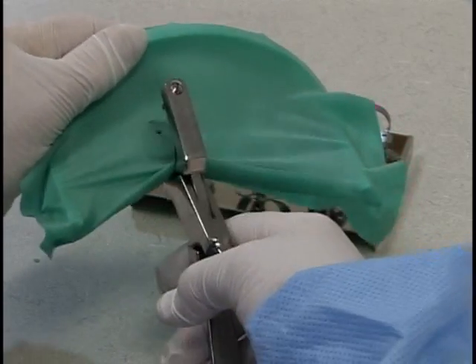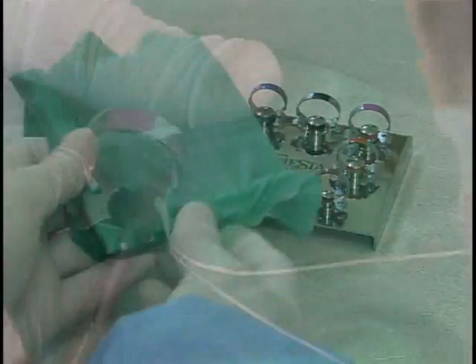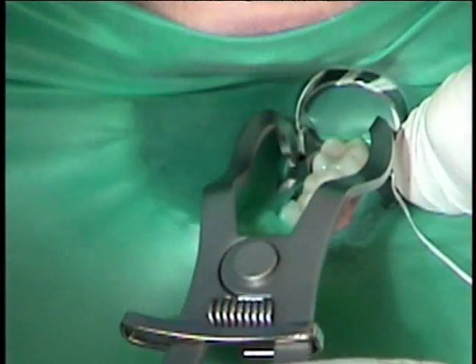The dam is placed on the frame and three holes are punched. Then the clamp is placed into the anchor tooth hole and a slit is cut between holes one and two. The dam is then carried to the mouth and the clamp is seated.